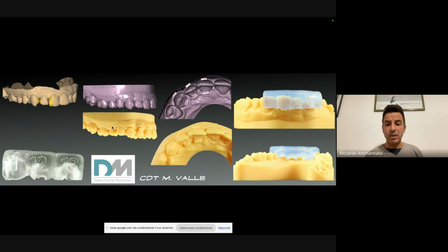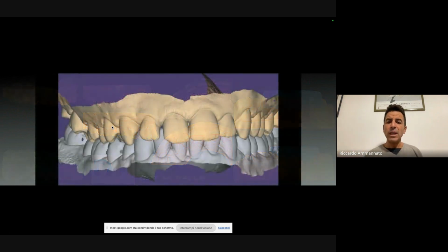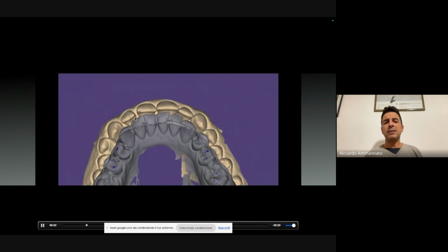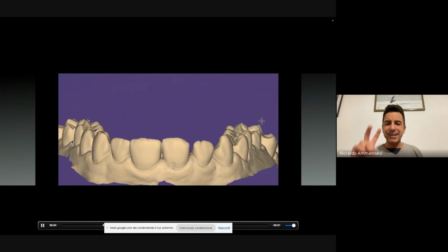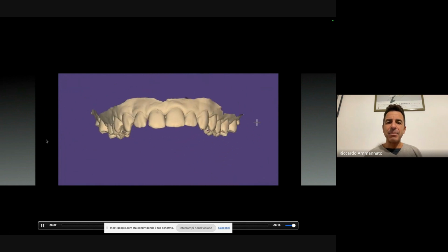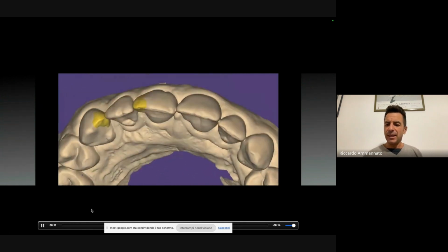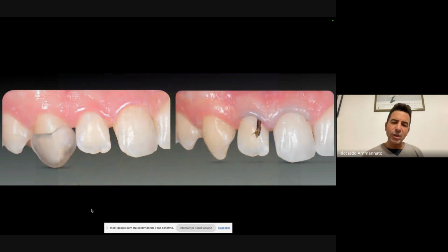So we did the whole project through the digital workflow. Here we have the technician, so he added the digital wax up, and you can see now, in a while, this is the digital wax up. I'm just going to go forward here. And he also delivered the indexes we have been doing for the last 2 years.